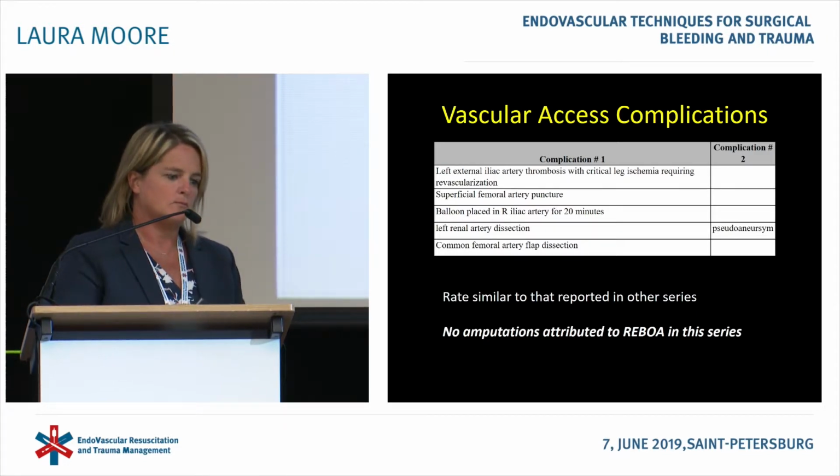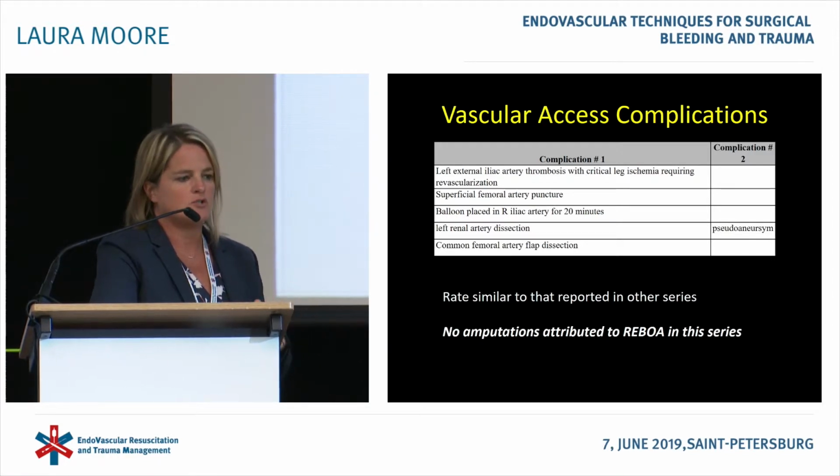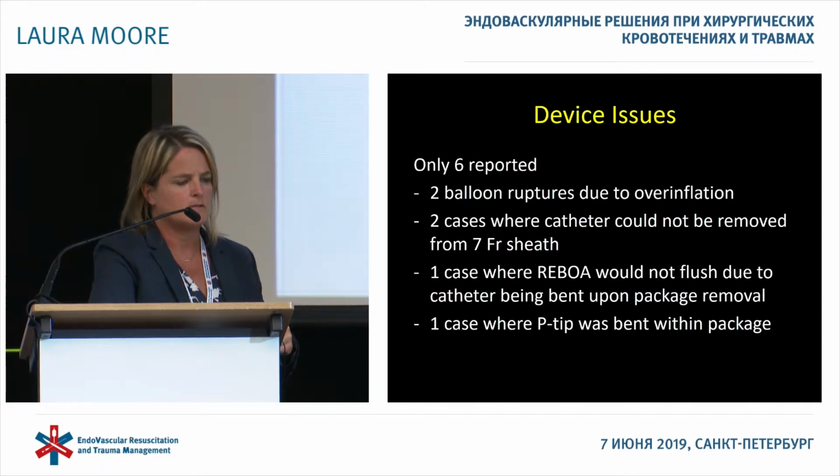I won't go over all these, but it was a relatively low rate of access complications, sort of the standard things that you would see, dissection. We had one incident where the balloon was inflated in the wrong position for 20 minutes. But we did not have any amputations, and we didn't have any ischemic complications, so no dead bowel, no spinal cord ischemia reported in this series of 75 patients.